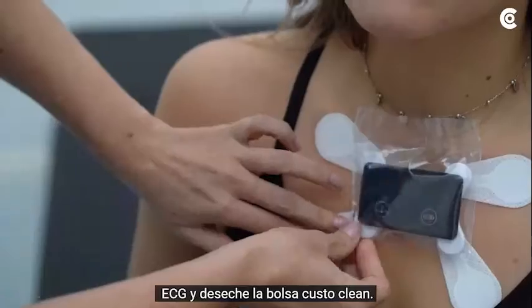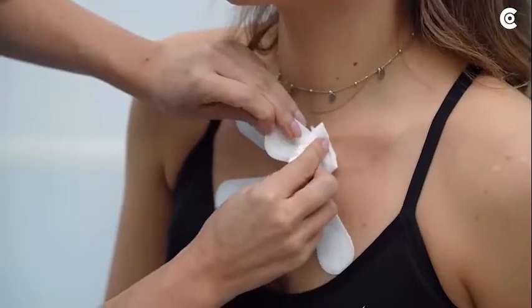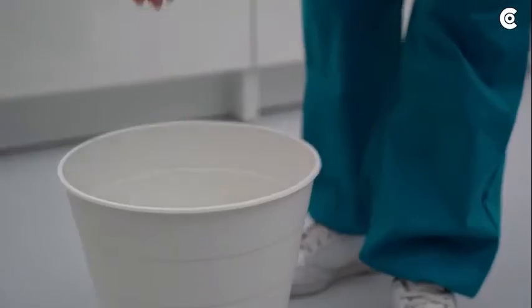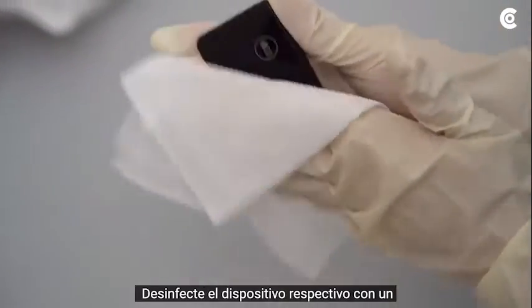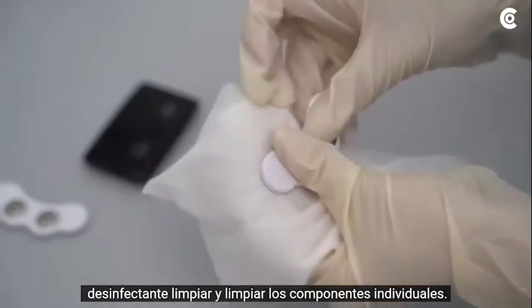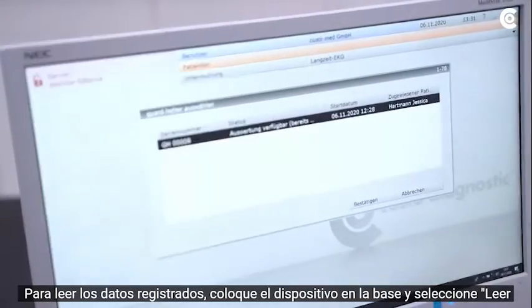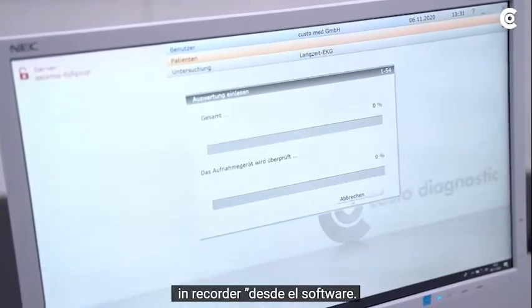Now remove the ECG and dispose of the CustoClean bag. Disinfect the respective device using a disinfecting wipe and clean the individual components. In order to read the log data, place the device into the base and select Read in Recorder from the software.